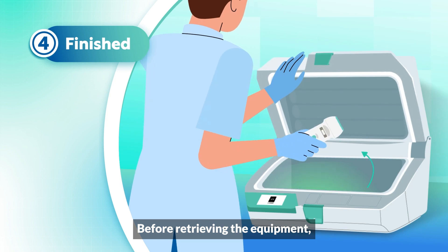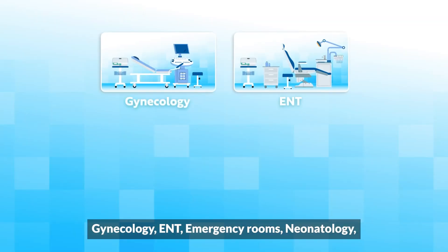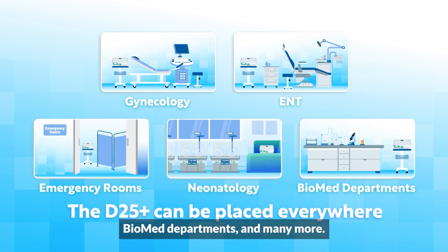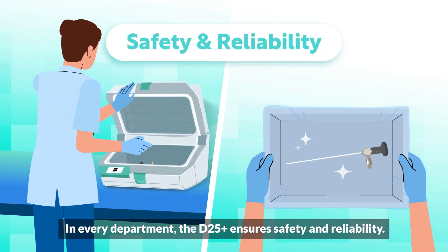Before retrieving the equipment, ensure your hands are disinfected. In every department, the D25+ ensures safety and reliability.